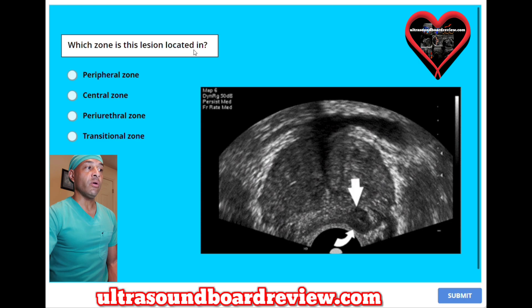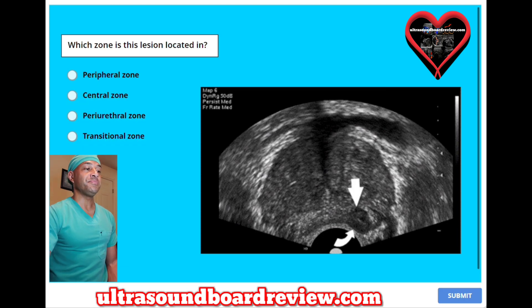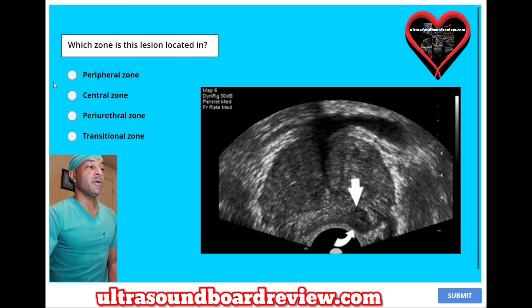Which zone is this lesion located in? A. Peripheral zone. B. Central zone. C. Periurethral zone. Or D. Transitional zone. The answer is A. Peripheral zone.